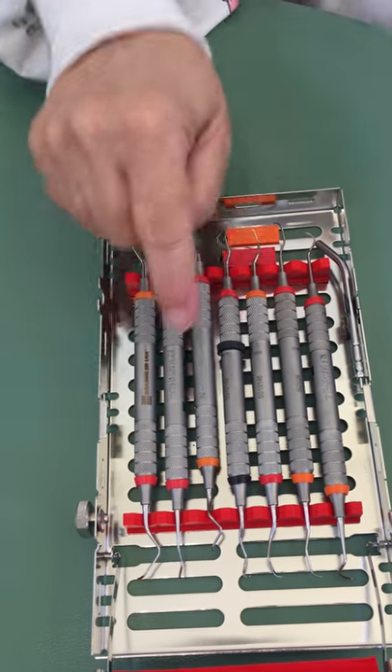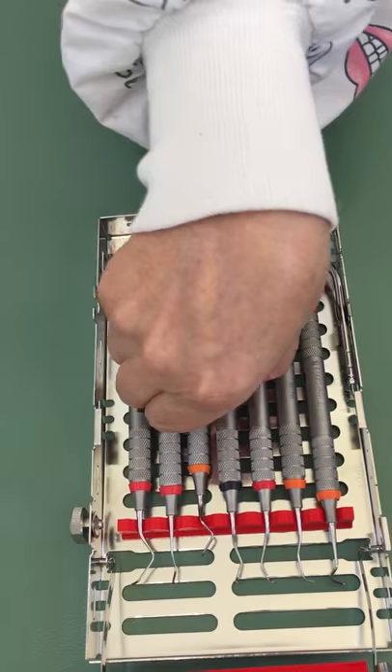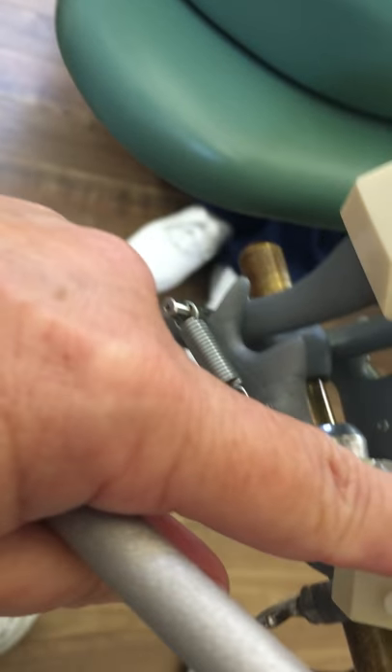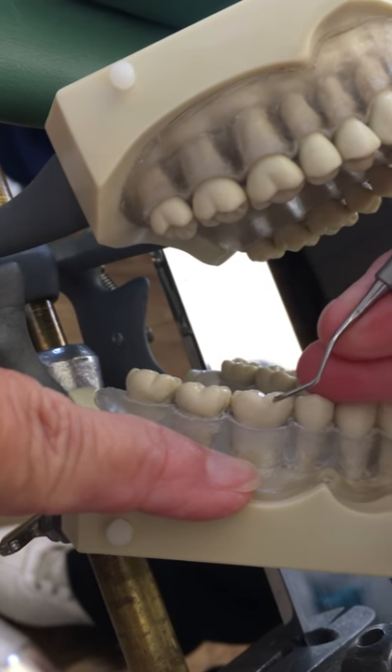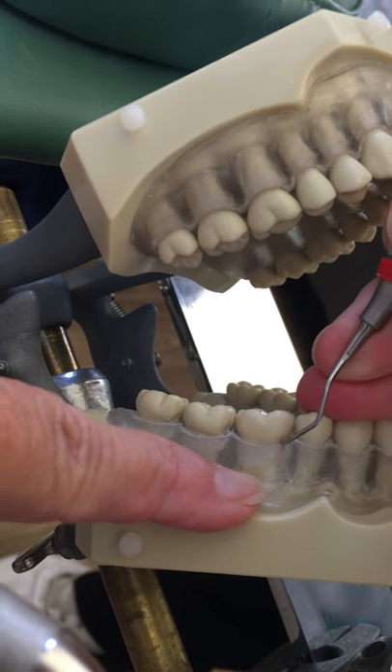So it might be hard to identify your instrument by sight, so we cheat a little and put a black band on it. This instrument is used in the mesial direction, so we're going to check it on the mesial. I put my fulcrum in and place it on the mesial.